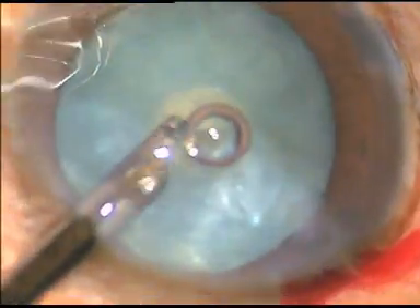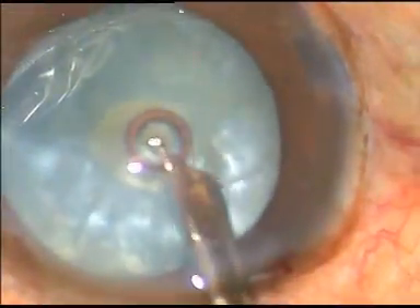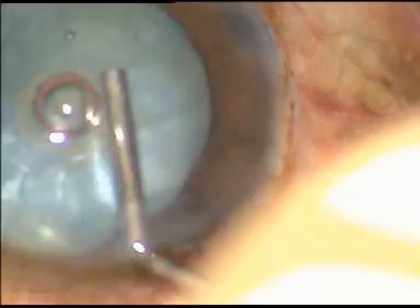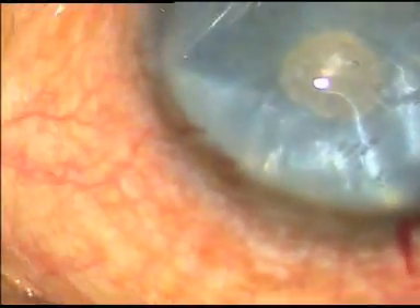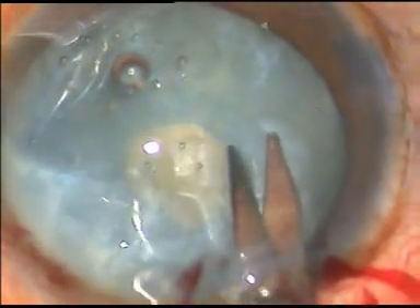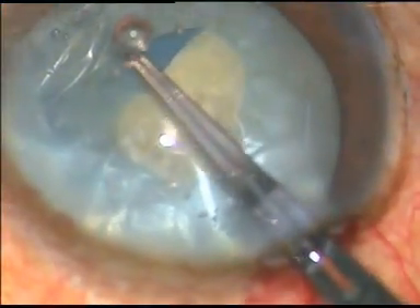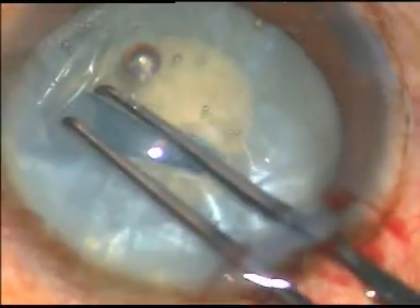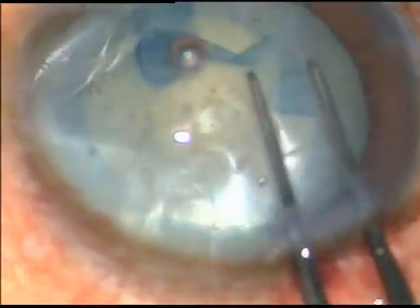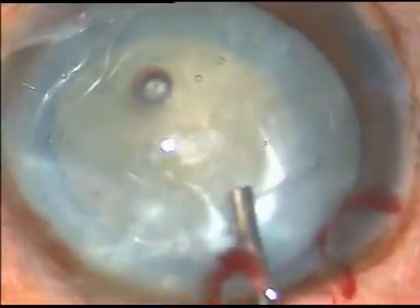Once this is done, viscoelastic substance is used — we use 2% hydroxypropyl methylcellulose. A Vannas scissor is taken and a cut is given at around 9 o'clock at the margin of the mini rhexis. The utrata forceps is again taken and an optimum-sized rhexis is performed, resulting in a fairly round, nice, continuous curvilinear capsulorrhexis.